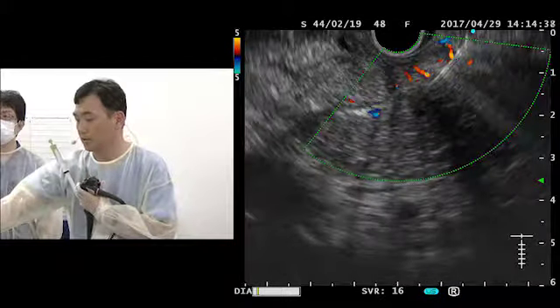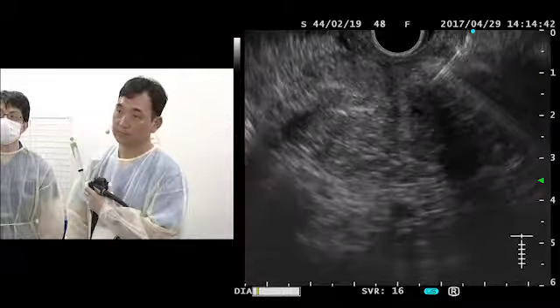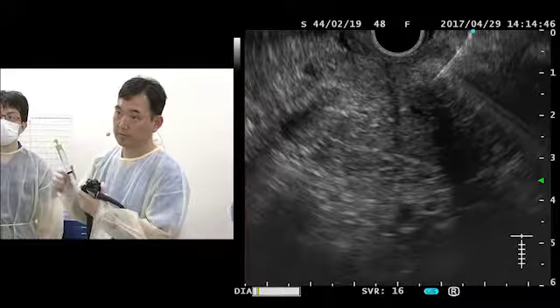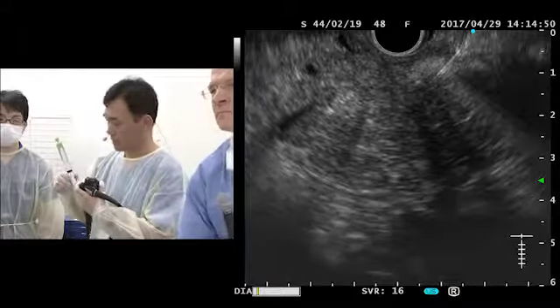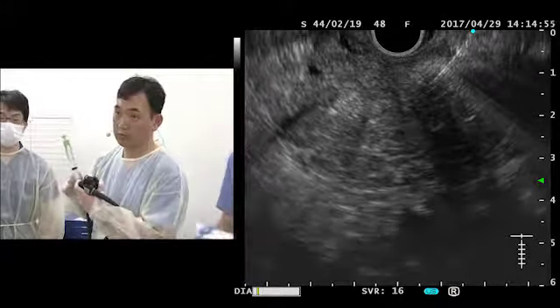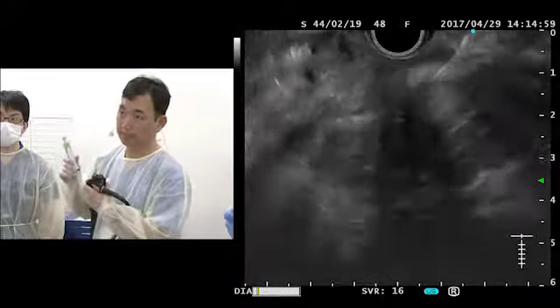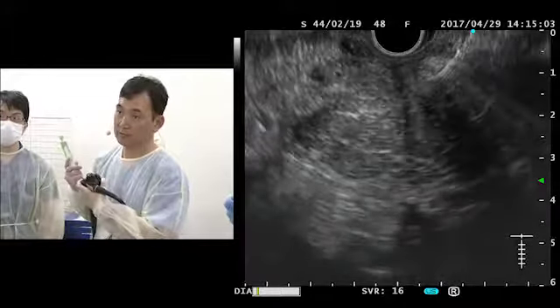you put the needle in. Once the needle is in, you have to take off the Doppler because it's going to be in your way. Now this is a rather firm tissue, as expected. So I put the stopper here so that it won't go too deep, and I have to penetrate much quicker. Oh, it may be a little bent.